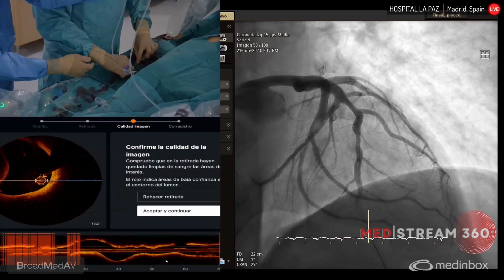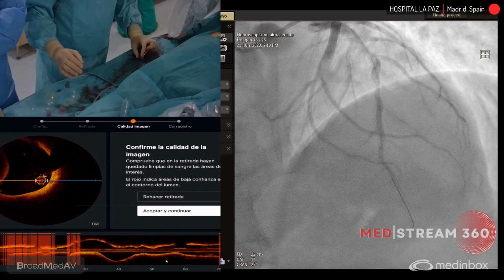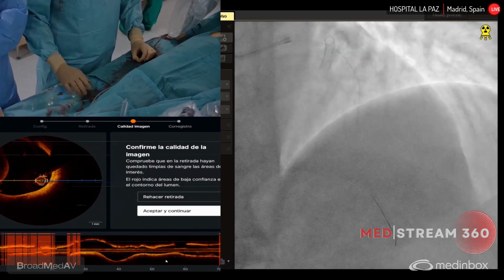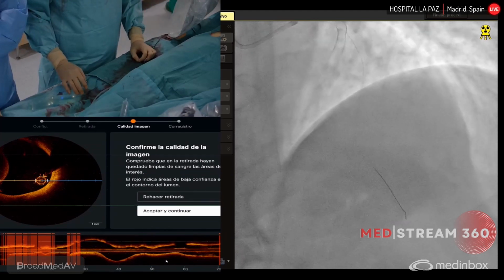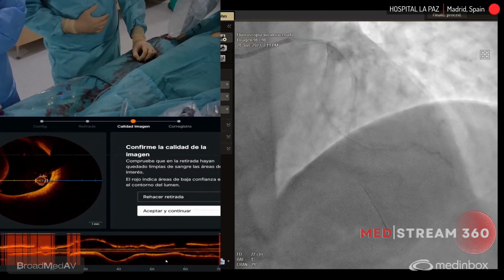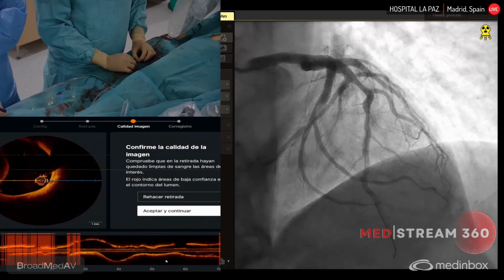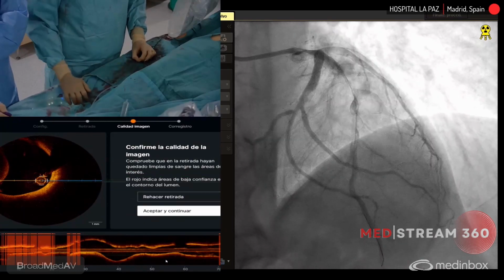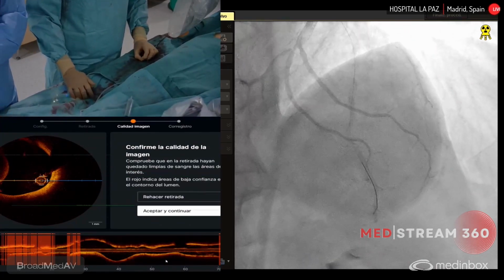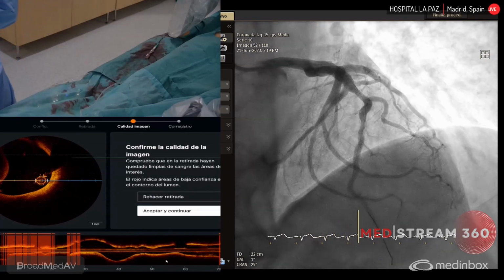The flow is improving. Okay, the flow is recovered now. Okay, let's check the OCT.